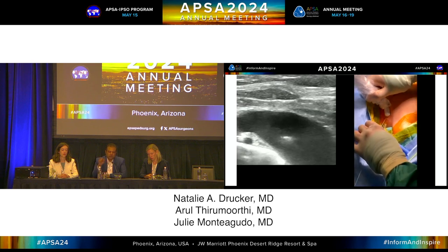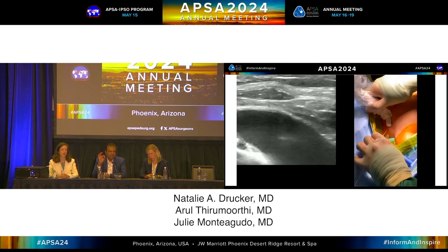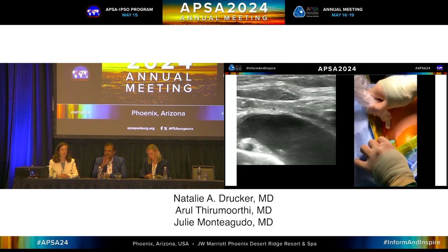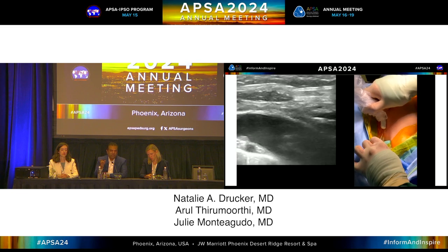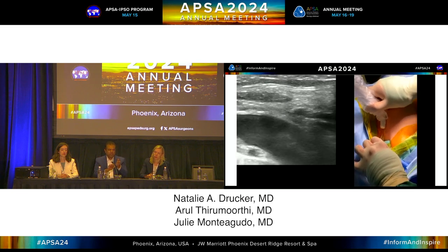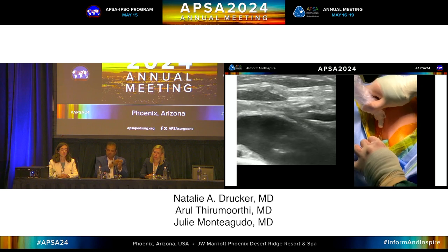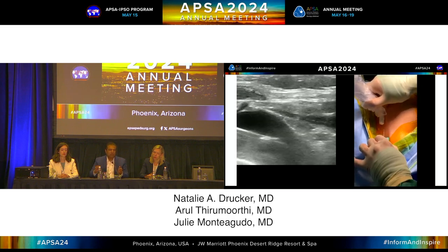But now this is rolling your hand, and you can see movement of the needle. So take the hub, and you're actually trying to take it towards the head. And that's going to swing the tip of the needle towards the feet, right? And that's how you can get it advanced. And then you roll your hand gently to watch the needle tip at all times to make sure you don't lacerate the vein. And that's how you get depth. And then you can get the wire down.